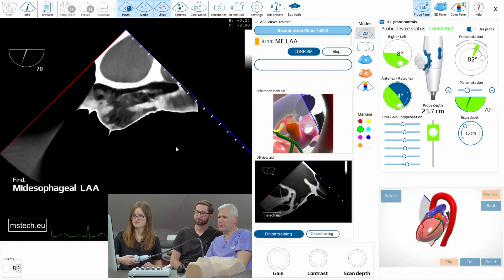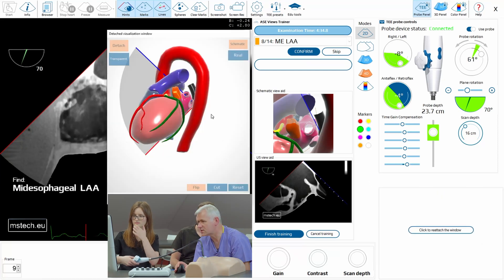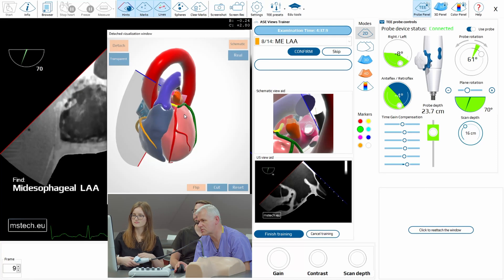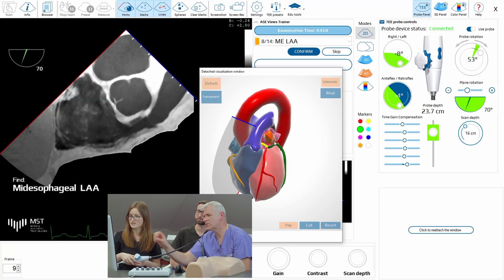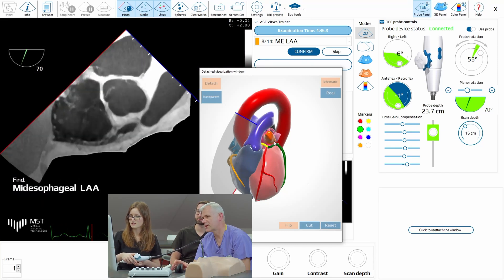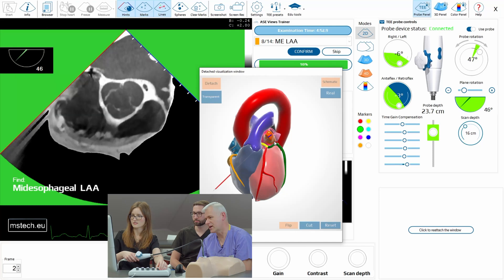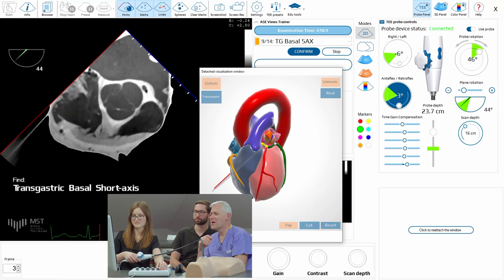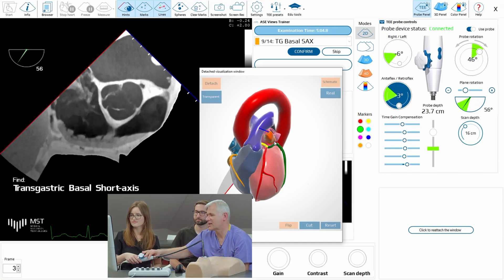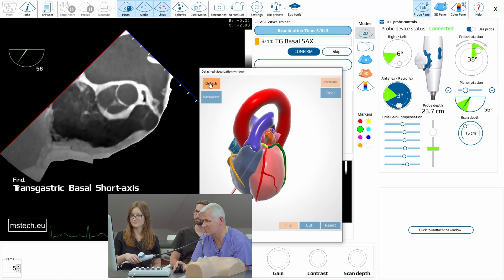And now mid esophageal left atrial appendage. Just look at the image and tell me where the appendage is and what you should do to get there. We should go somewhere over here. Yes — try to move the probe and see what happens. The proper way would be to keep it at 60 and just rotate slightly. But you did it right — you can do it this way as well.